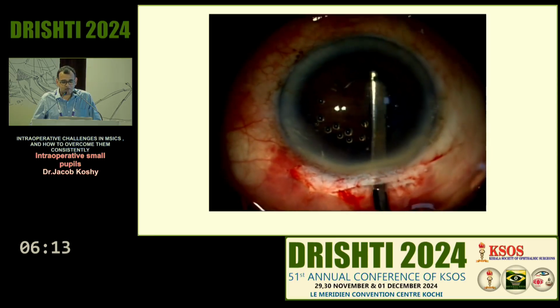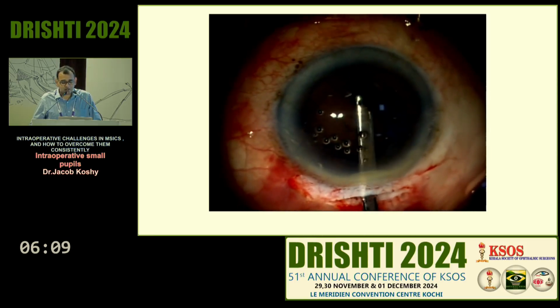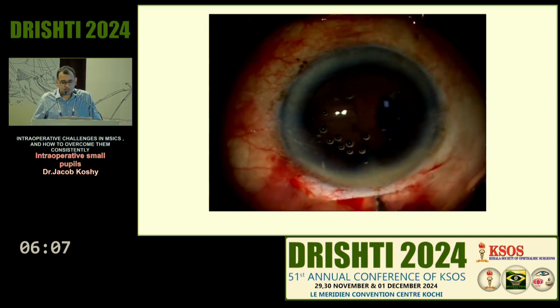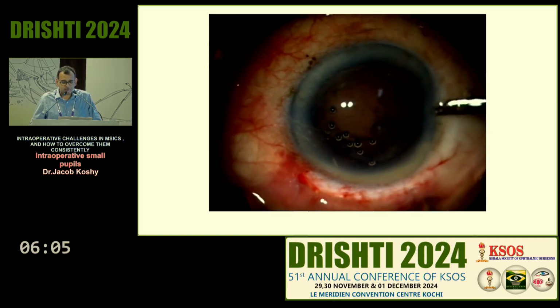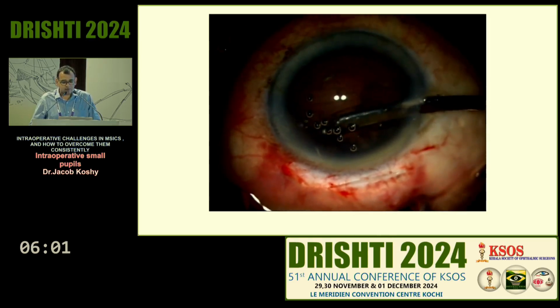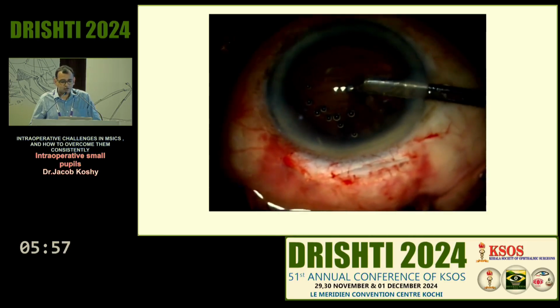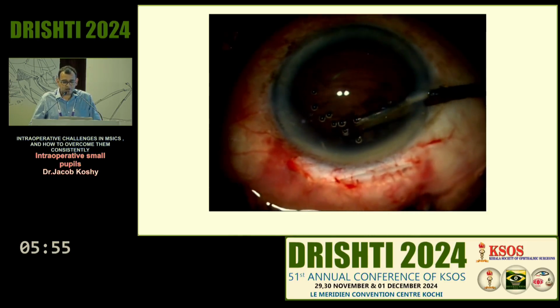Once you've done a good vitrectomy, a dry aspiration, you keep putting viscoelastic and do a dry aspiration. Unless you're very sure, don't have fluid flowing into the eye, it will just go and hydrate the vitreous and more vitreous will pop out. But you can do a dry aspiration, keep it in retroillumination and try and see what's going on.